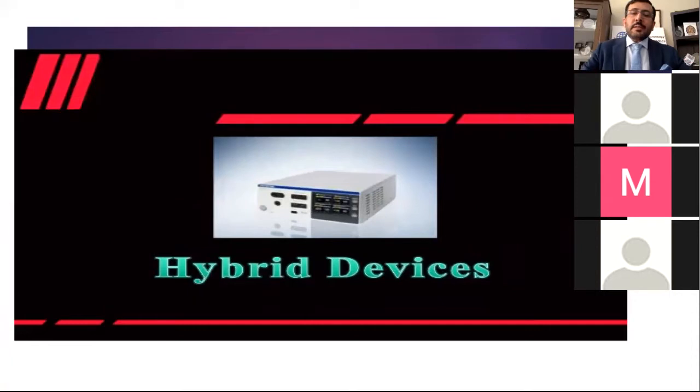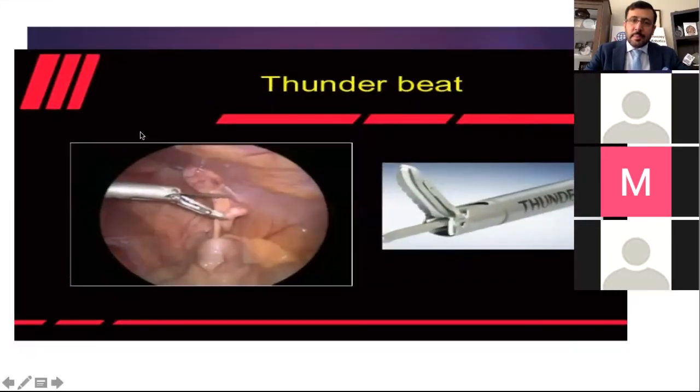We have some hybrid devices. Also, I remember at the last Arab Health, there were some companies from South Korea, and that was 3-in-1. That was amazing. They have four in one: in the same instrument, monopolar, bipolar, LigaSure, and also harmonic, in the same small size. So hopefully we will see it in the market soon. That was a good instrument. Yes, Thunderbeat, I have also used this. This is also a good instrument, also for dissection.